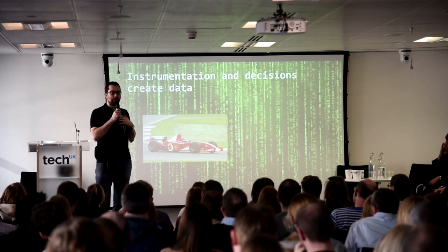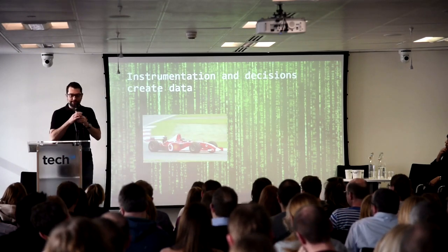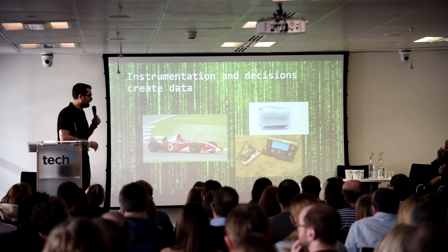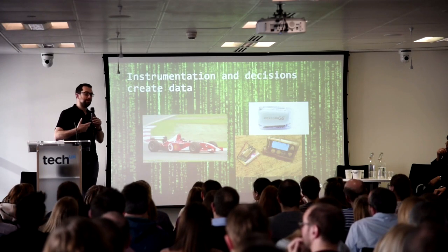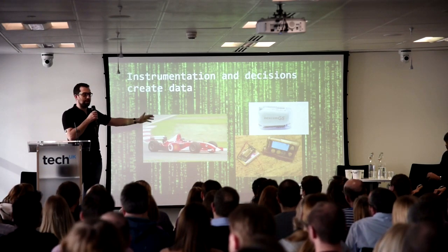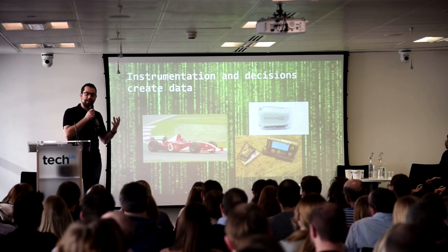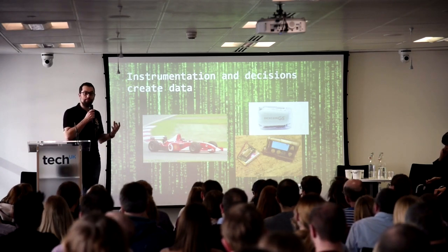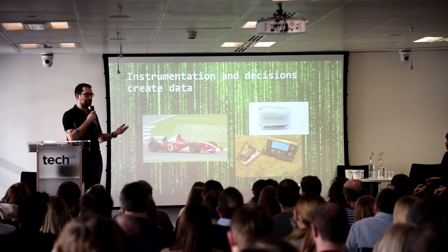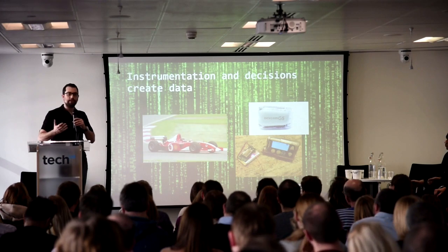So for me to find out what my glucose level is, I have to go and do a finger prick or wear a Dexcom. And in fact, if I want to know even more about what my body is doing at a point in time, I need to take a bunch of data off a pump and off the Dexcom that I'm wearing, and then interpret that data to decide what else is going on in my body, like is my insulin sensitivity changing? Do my carb ratios change? What other things are going on?